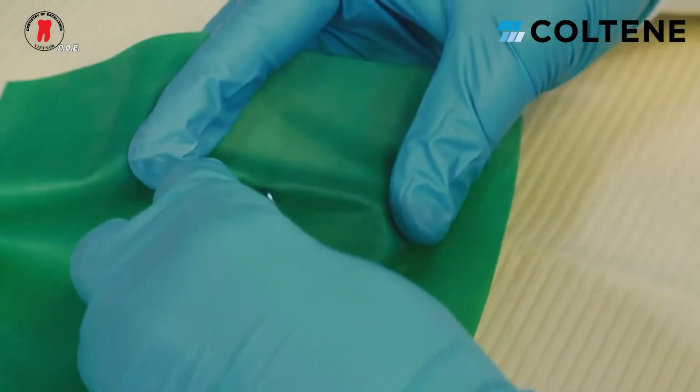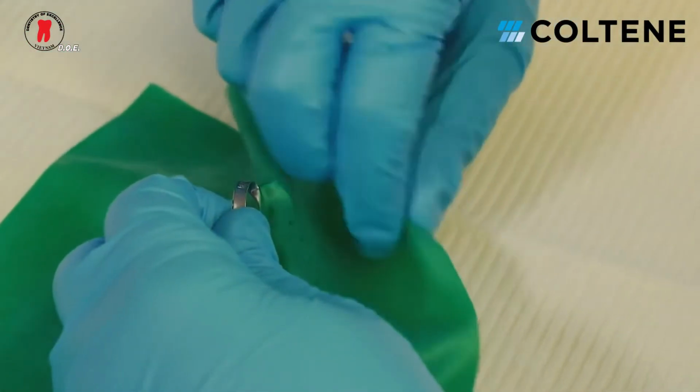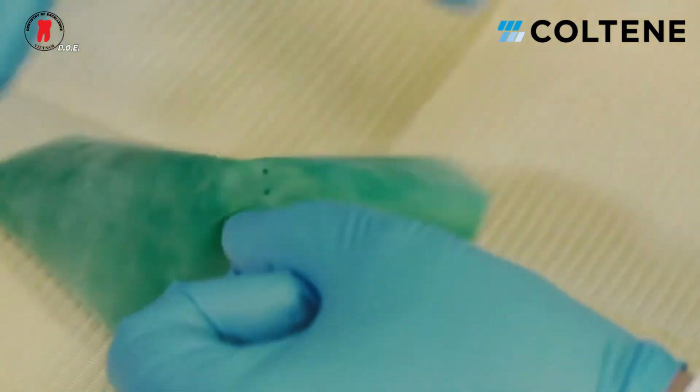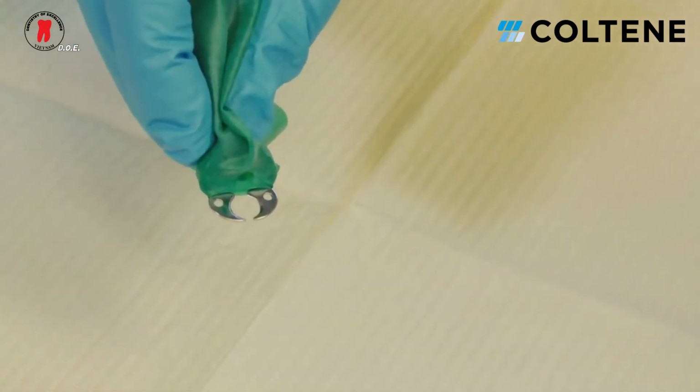I make sure that the jaws of the clamp are centered with the holes, and I'm ready now to take this clamp into the patient's mouth, holding the rubber dam in this way so that we can protect our patient.